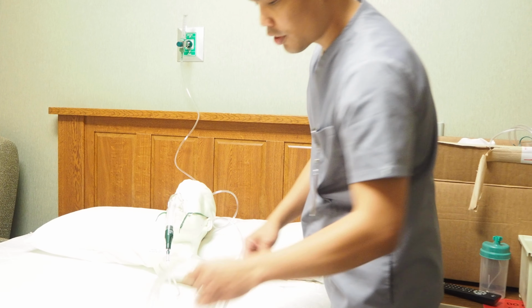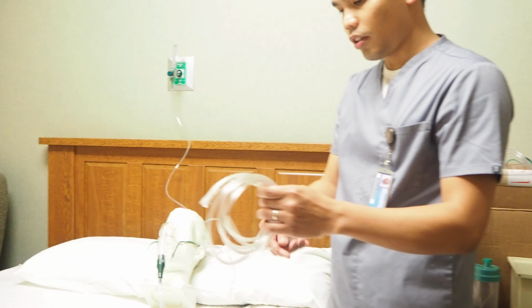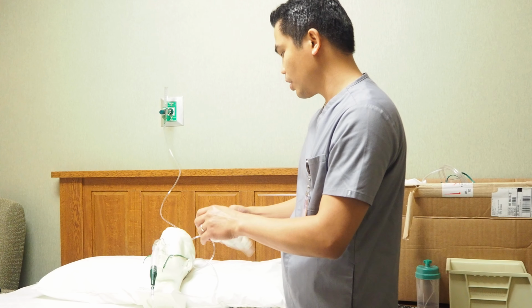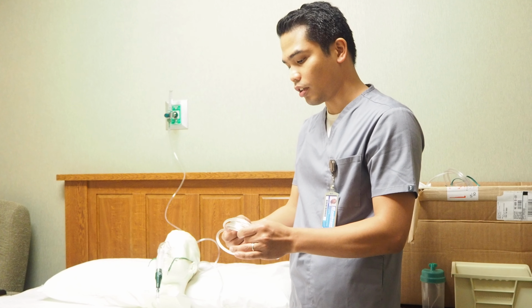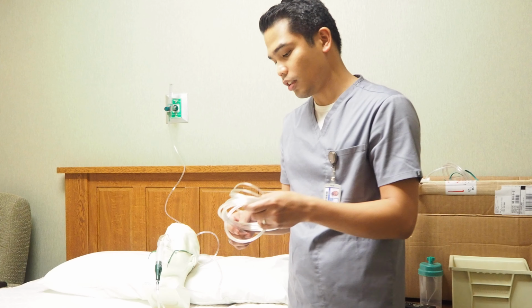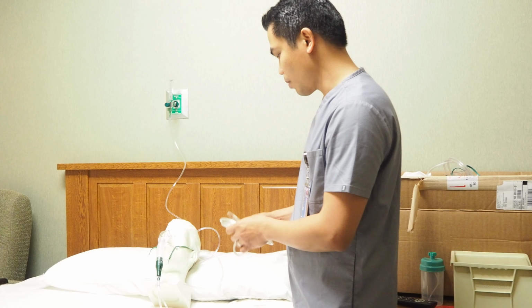And then the nasal cannula, we can just put in a clean plastic container or plastic bag, and set it aside so that later on, in the long run, they may want to use this if the patient is stabilized.